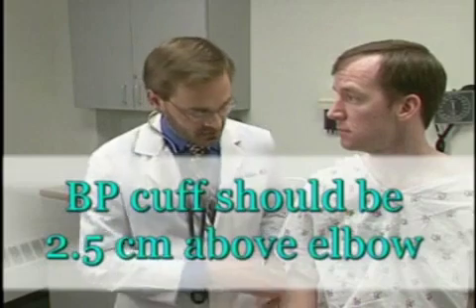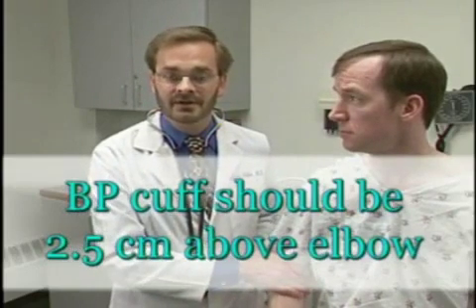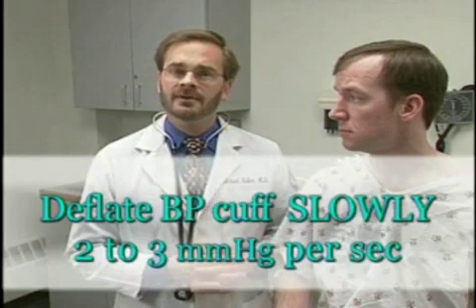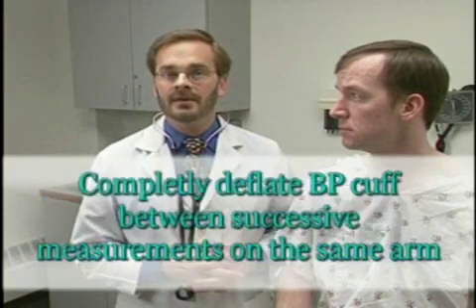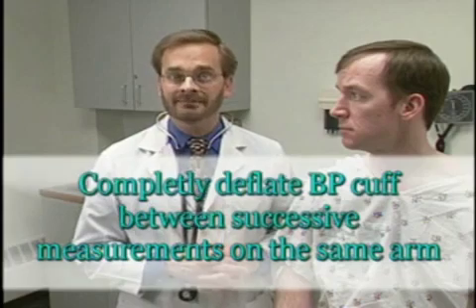And also, if the cuff is too low on the arm, you'll occlude the brachial artery and it'll be difficult to hear it. Next, if the patient's not relaxed, if they're upset or crying. And then if you deflate the air from the blood pressure cuff too quickly, the air will move down so fast you won't be adequately able to tell where the diastolic and systolic blood pressures actually are.